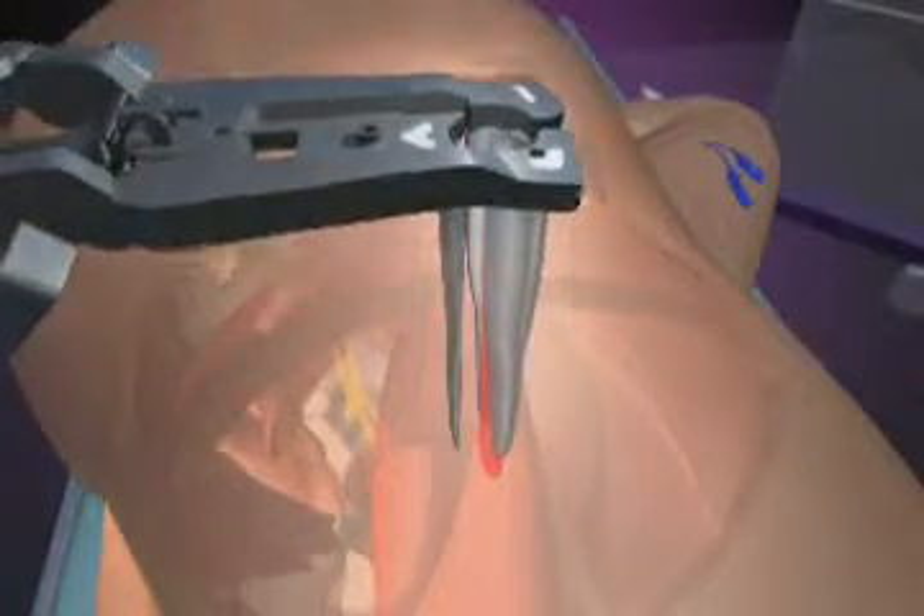Once the intervertebral implant is in position, the retractor is removed and final confirmation x-rays are taken. The small skin incisions are closed with a few stitches and a bandage.